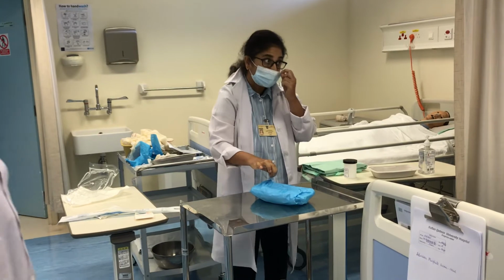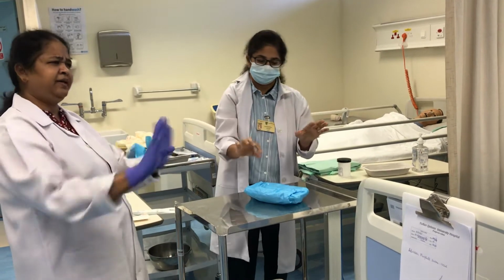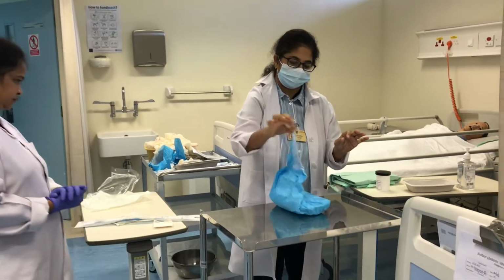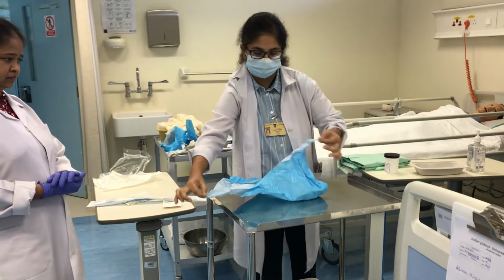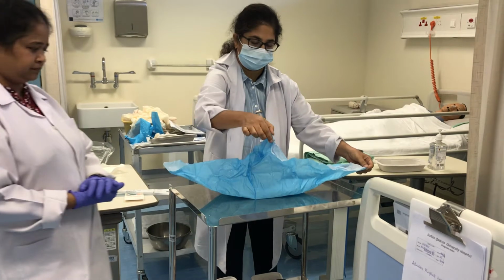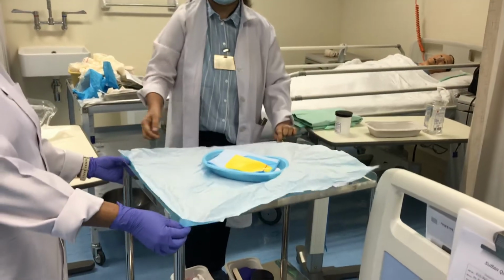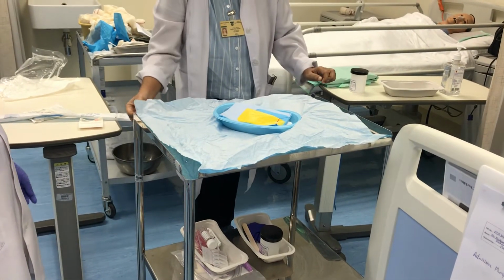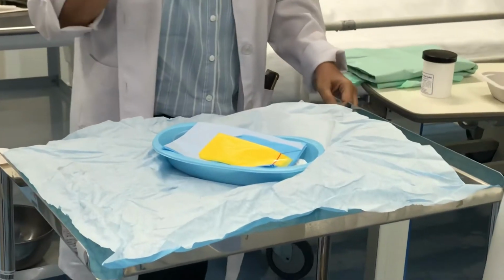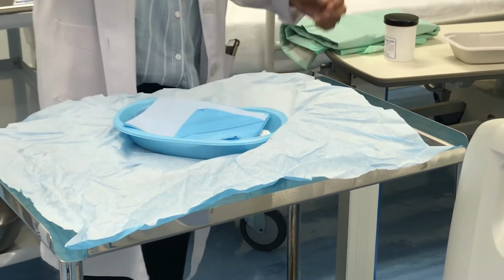Do you need to wear sterile gloves before? No, just after the medical hand wash. Same as dressing, keep everything ready, then only you will go for it. I'll use the tips for opening the folds. Yeah, same like dressing. So we have the items here. And also we can take the yellow one, and you can pick it up.